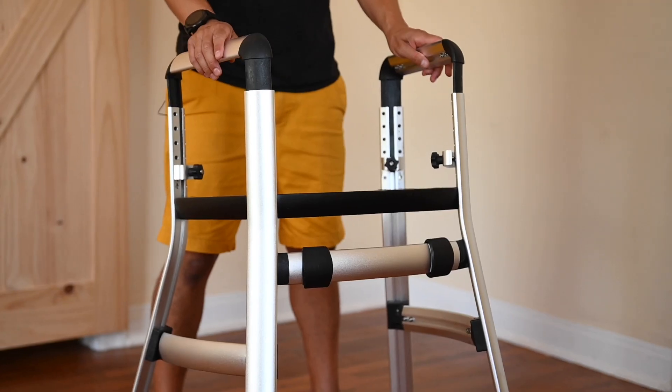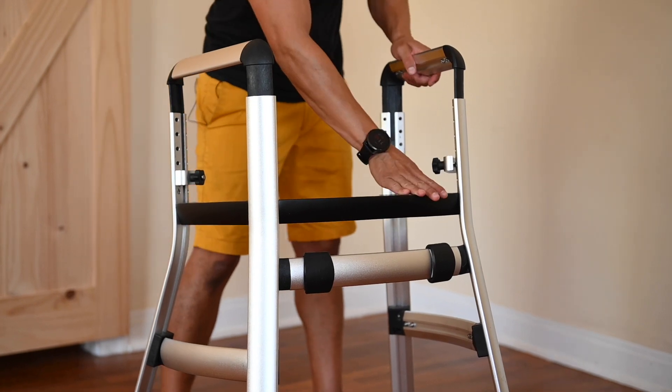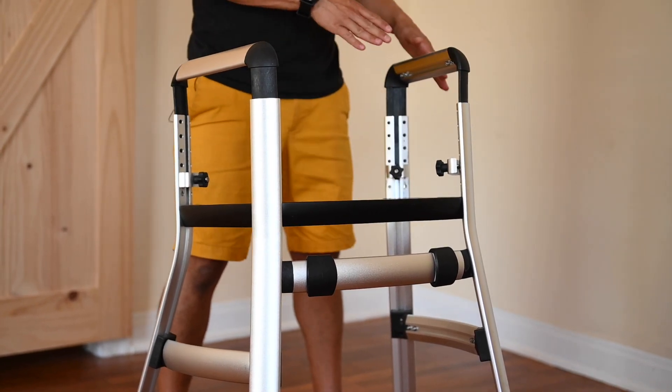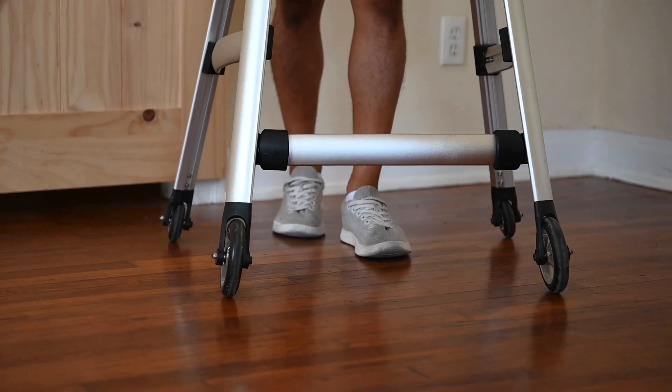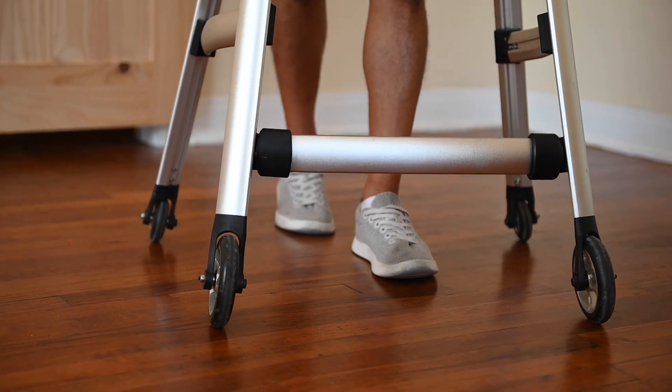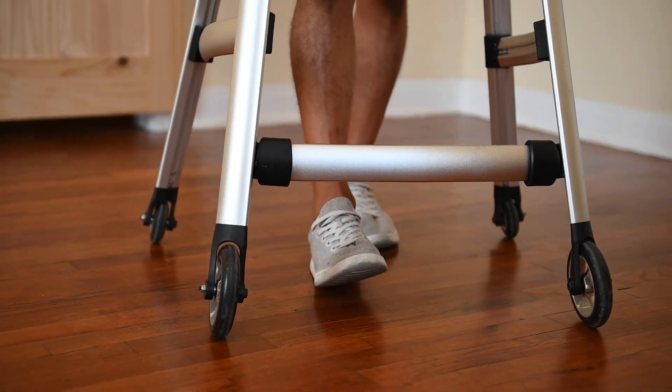This is why we put the adjustments for height at the top, so we're able to adjust the armrest to make sure that the lower part of the walker is nice and stable. Designed for indoor use and on smooth surfaces, the four wheel smooth tread allows for a safer and more fluid walking experience.